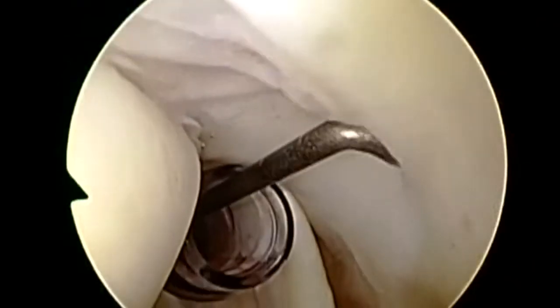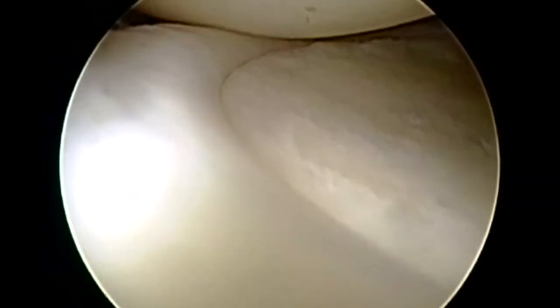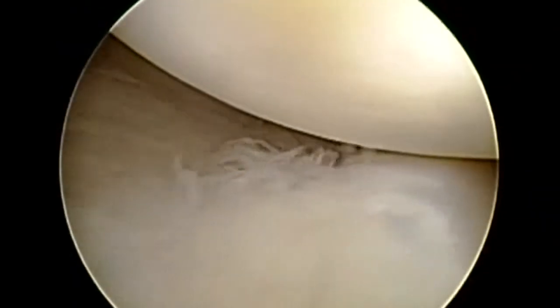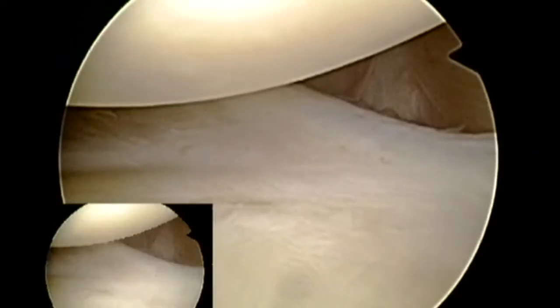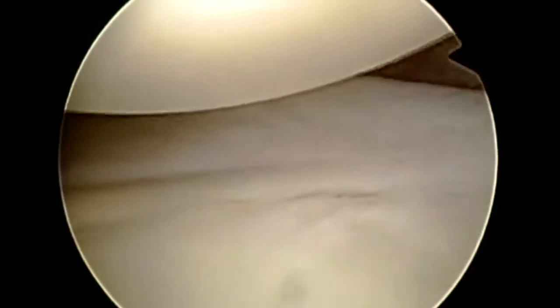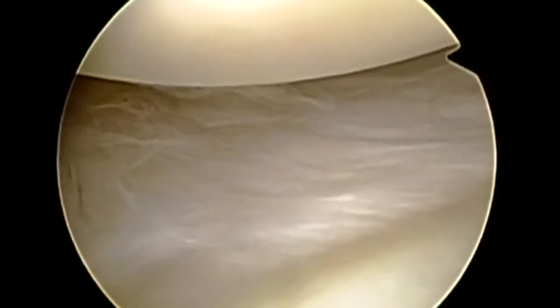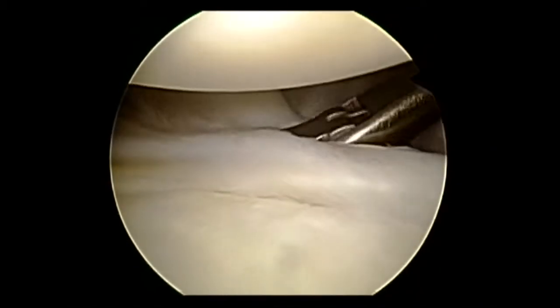You can see here she does have evidence of a partial rotator cuff tear, a partial articular side rotator cuff tear. And this was confirmed on MRI, as was the diagnosis both clinically and via imaging of adhesive capsulitis. You can see there her superior labrum was quite inflamed, and now we're seeing thick bands of scar tissue in her anterior and anterior inferior capsulolabral ligamentous tissue.